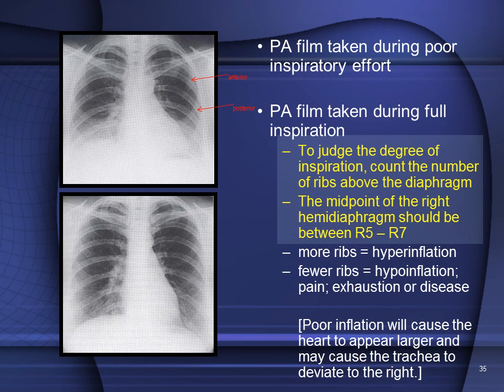However, if you use the posterior component, secondary to the angle of the rib and how the rib curves around the thorax, then the number that we look for is between 7 and 9. Neither method is more accurate than the other, but you should choose a method and stick to that method when you make your interpretations.